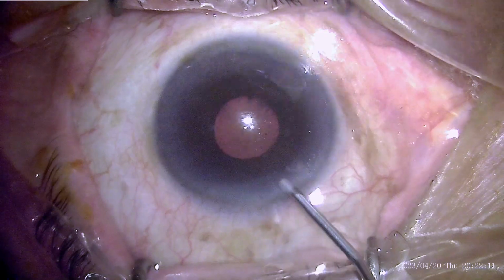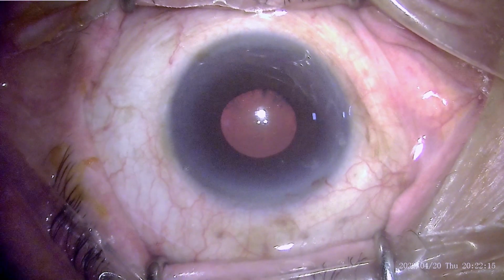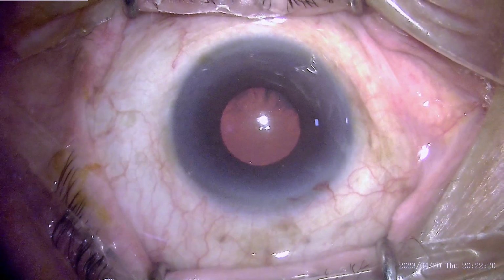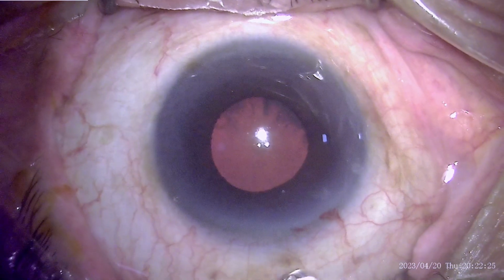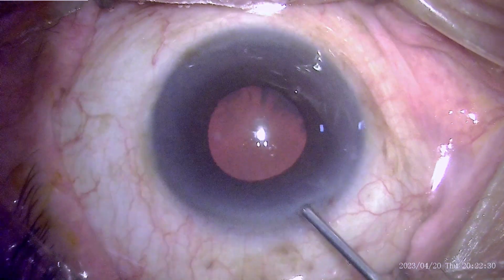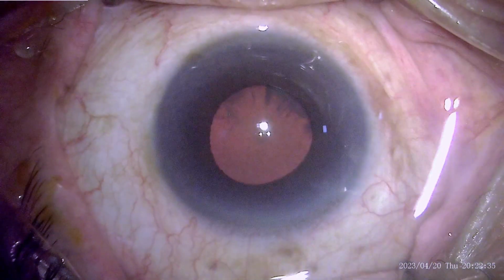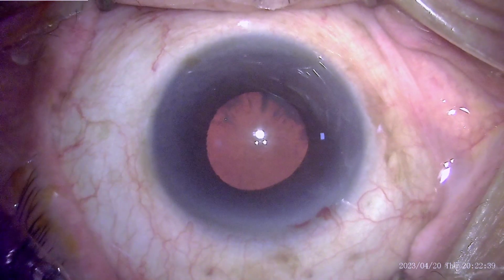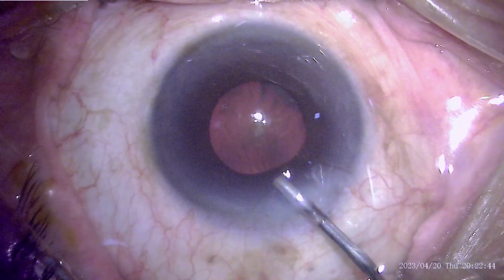This is available as tropicamide plus phenylephrine, which can aid in pupillary dilatation during the surgery. As we can see, some help has been achieved and the pupil has dilated slightly more, probably because a higher concentration is delivered. Second comes the intracameral injection of lignocaine with adrenaline. The concentration is 0.5% lignocaine, and we can see the pupil has dilated slightly and is now something like 4 millimeters in size.